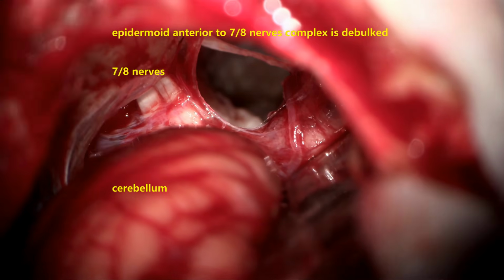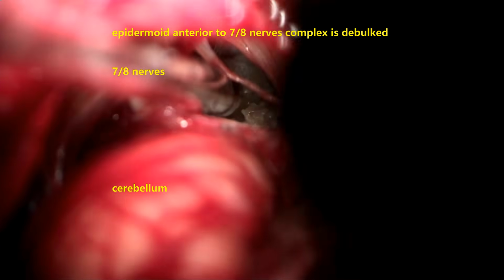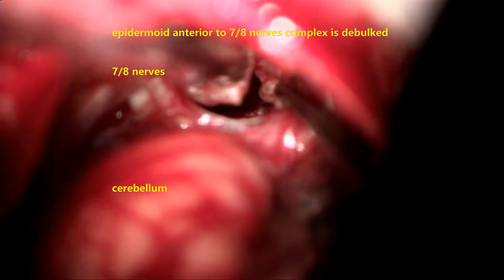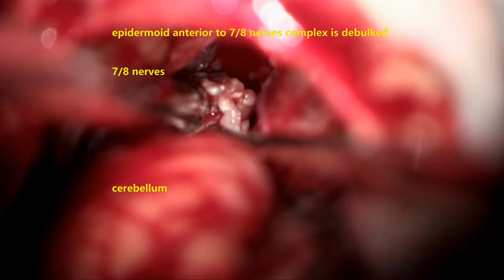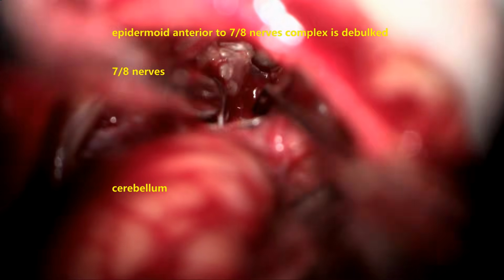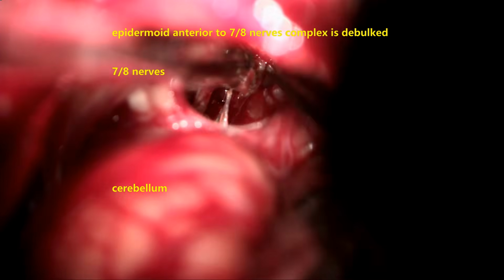the arachnoidal plane. This is of utmost importance because both are very sensitive nerves, and if we handle them more, inadvertently we may cause deficits in the form of hearing impairment and severe vertigo or giddiness that the patient may have postoperatively.